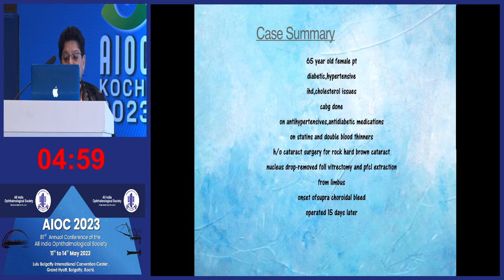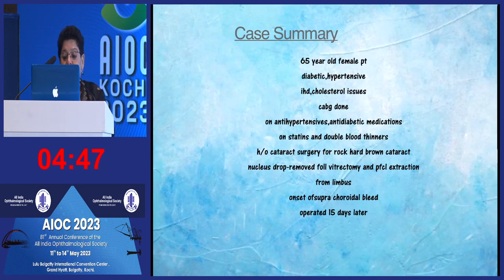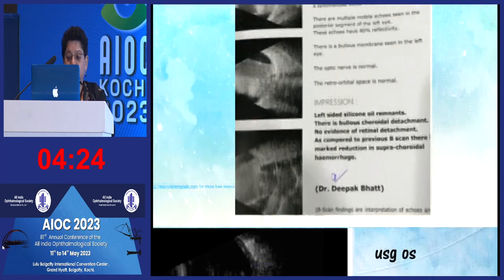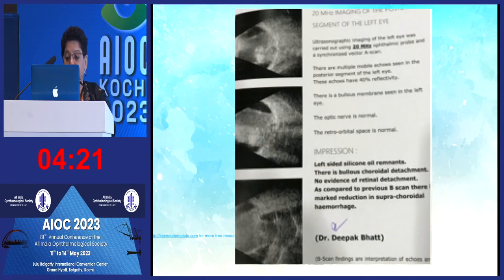Now, she had a history of cataract surgery for a rock-hard brown cataract. She had a nucleus drop, which was followed by vitrectomy, PFCL and PFCL extraction of the nucleus. There was an onset of a suprachoroidal bleed at that point of time, which was then operated 15 days later. So let's go over to the surgery. This was after the suprachoroidal bleed occurred. So this was the USG, and this was the USG done a few days later, where there was no evidence of retinal detachment, and it was just a bullous kind of choroidal detachment which was seen.